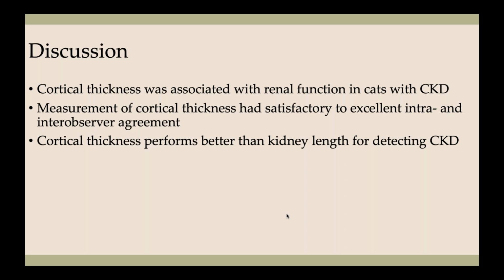They do say that the measurement of the thickness had satisfactory to excellent agreement, which I would love it if it was excellent agreement, but I'm not really that thrilled with just having satisfactory agreement between observers.